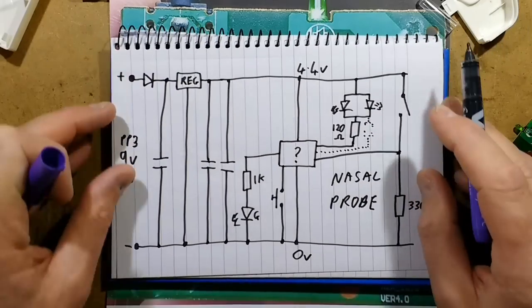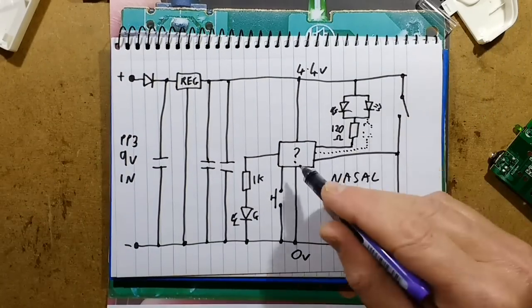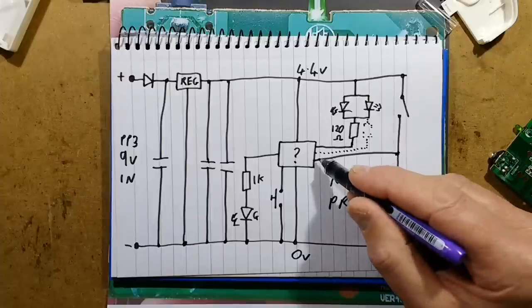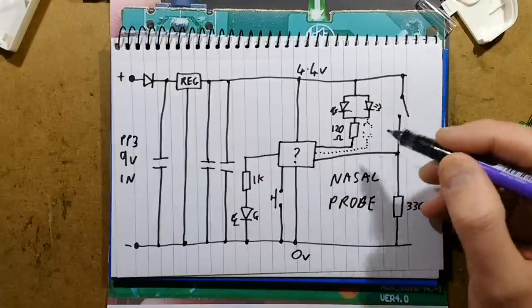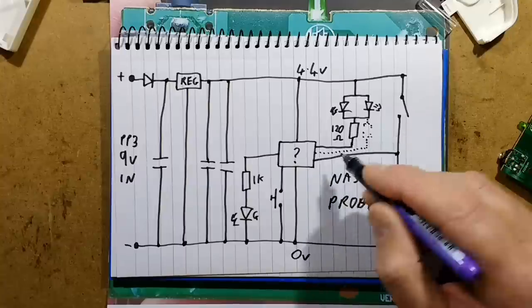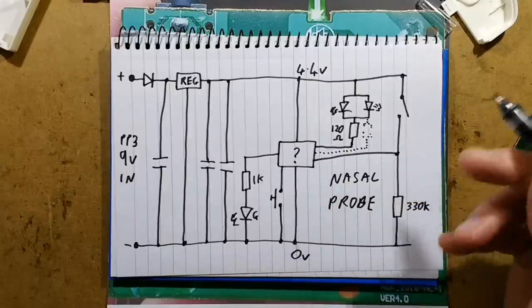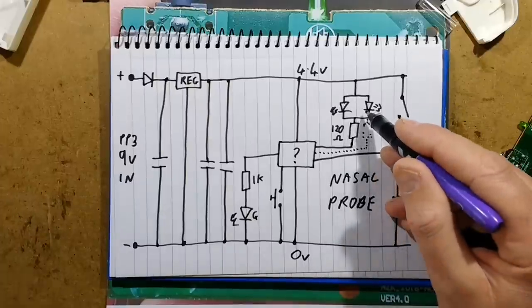I wonder if they had a conflict in the software — if one output was going high and one going low. A sudden current drop maybe caused problems, or if one was left high and one left low while writing software, it would have drained the battery flat very quickly by shunting those resistors directly across a high and low output of the microcontroller. But that one resistor now drives the two LEDs in parallel.